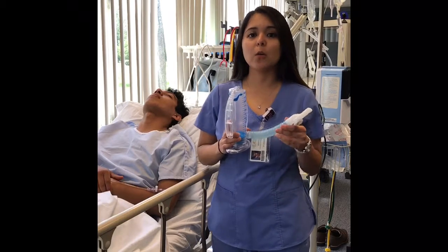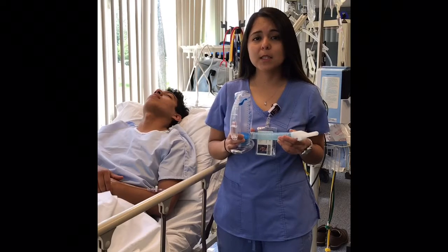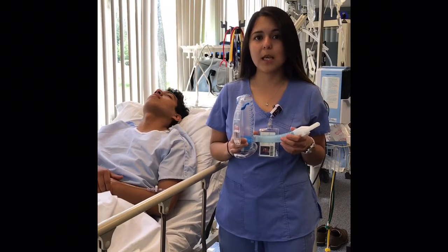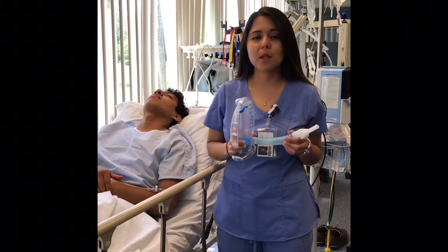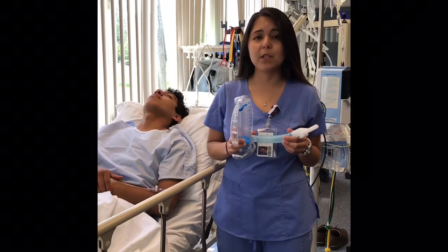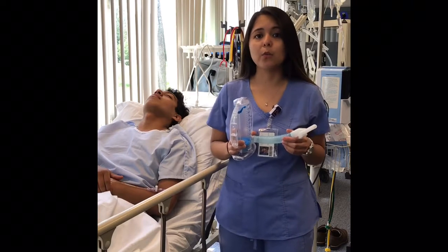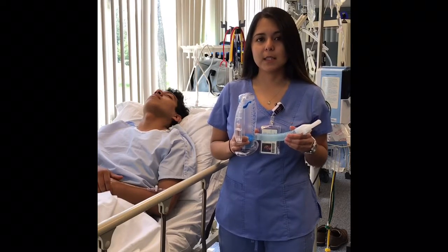Incentive spirometry, or more commonly known as IS. We will talk about what it is, the indications, the contraindications, the complications, and the outcomes. So what is IS? It's a simple form of lung inflation therapy that uses a sustained maximal inspiration maneuver. It is used in the treatment and prevention of atelectasis.